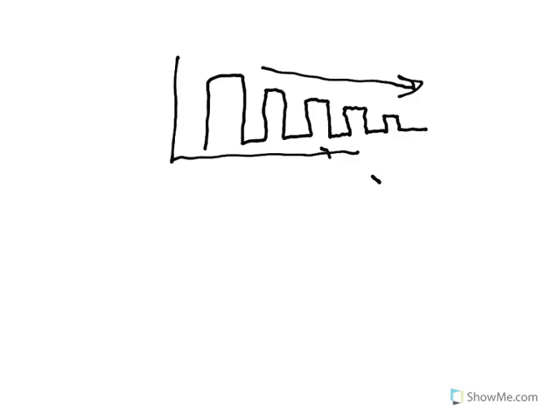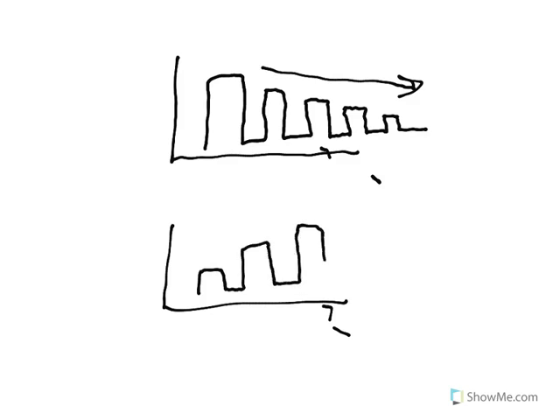So they're getting worse. Now, obviously, in the reverse, if I saw something like this, yay, my patient's getting better. And you might, in fact, see this out of a cardiac arrest patient. You may see something like that. Wow, that's a really good arrow.